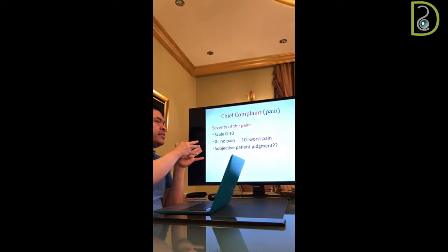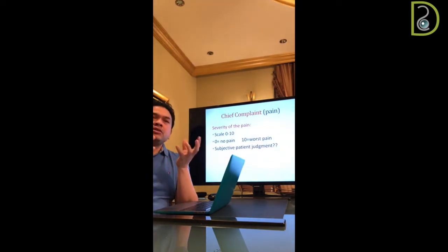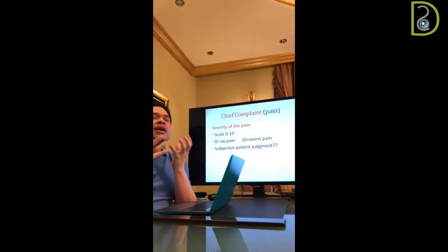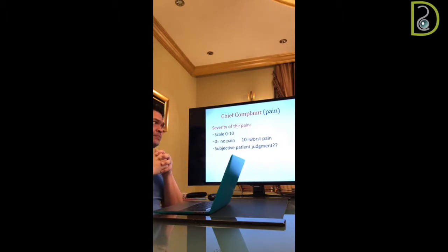This depends on the patient's threshold, and it is not an absolute indication for our treatment, but it gives you some hint that the pain starts with maybe 2, then becomes 9, then again goes back to 2 or 4. So it gives you some hint to understand the histological status of our pulp reaction to our treatment.